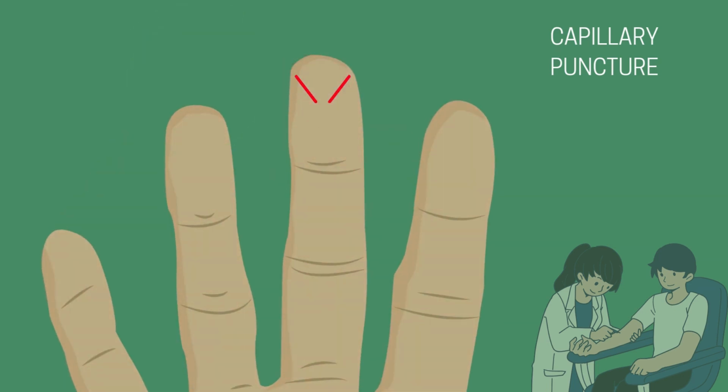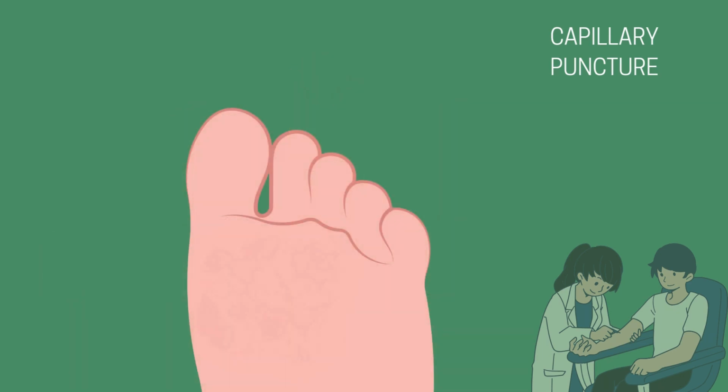It should also be taken across the grain of the fingertips in the direction noted above, as it allows for a nice drop of blood to form and for the blood to not run down the hand. For infants over 6 months and young children, finger sticks may still be used, but care must be taken to ensure the finger is warm and the puncture is shallow to avoid injury. In some cases, the big toe may be used if fingers are not accessible.